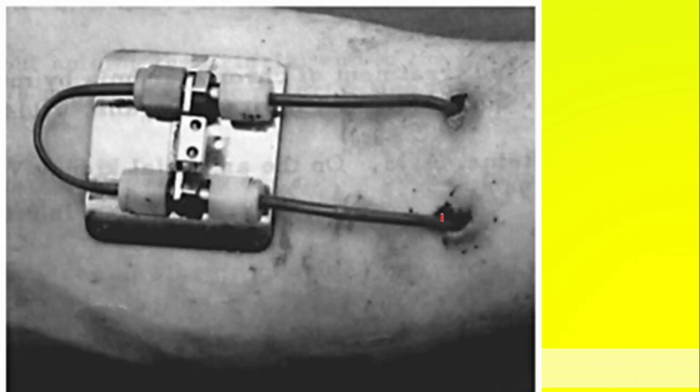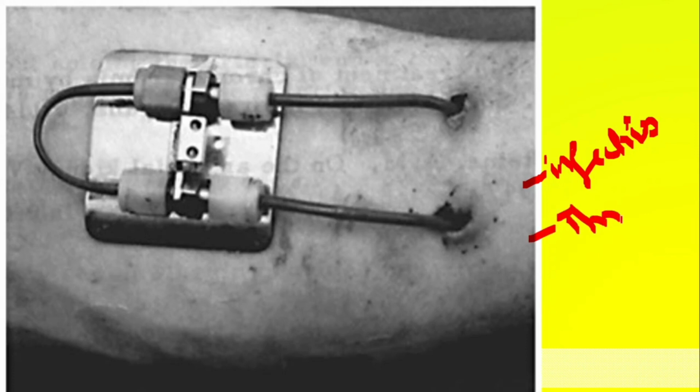This is how it appears. In a nephrology quiz, they might keep this image and ask you what it is. This is the Scribner shunt. Since it is an artificial shunt, there are chances of infection and chances of thrombosis, and there is a difficulty in placing this. These are the problems which were encountered.